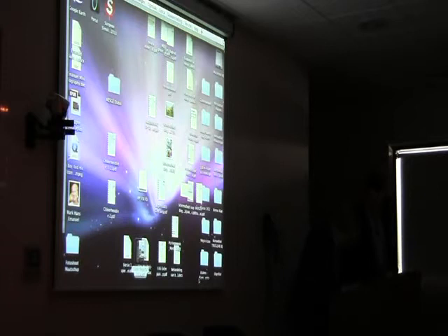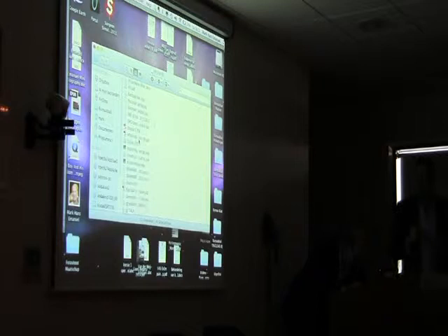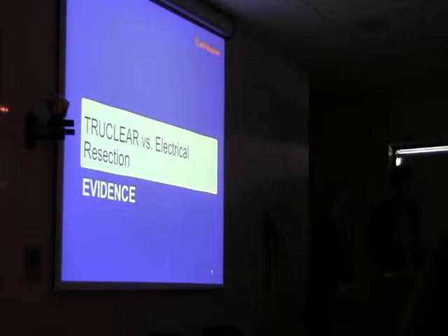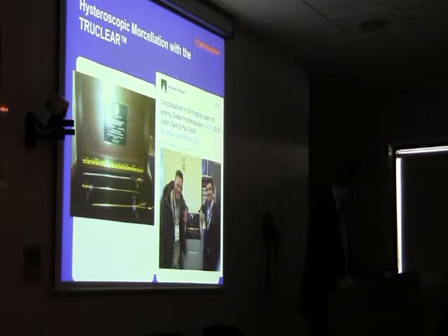So what we did is we randomised between use of the, in the outpatient setting. We randomised between what I showed you with the VersaPoint electrode and the morcellator. Any woman that had a polyp, it didn't matter if it was for fertility reasons or any bleeding reasons, we weren't bothered about the indication. But we randomised them to having it removed with the morcellator, the TruClear morcellator, or the VersaPoint electrode.